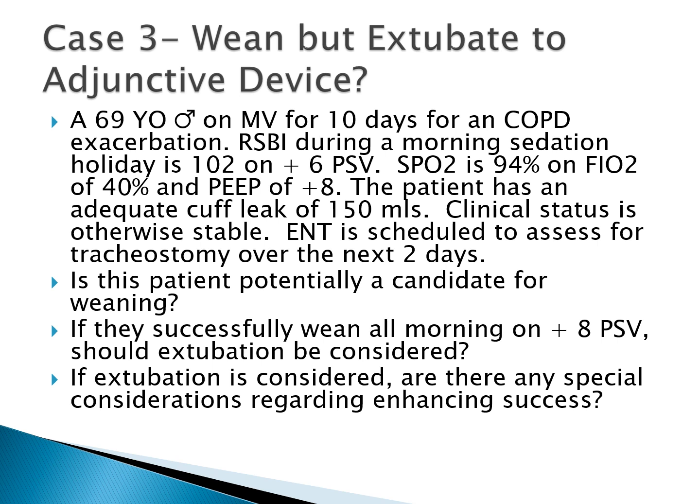Should extubation be considered? What I'd like to see, and I didn't say it in this case, is how they do on 5 or 6, and see if they're decent on that. So yes, they can be considered for it, but in view of everything going on here, whether you extubate from 8 of pressure support or bring them down to 5 or 6 of pressure support, they probably should be extubated to an adjunctive device.